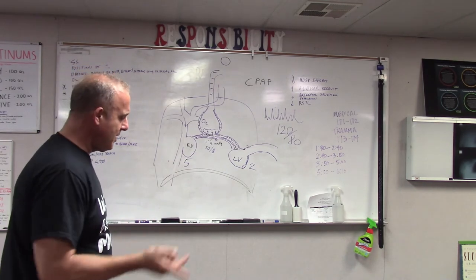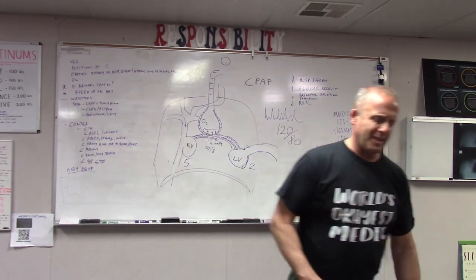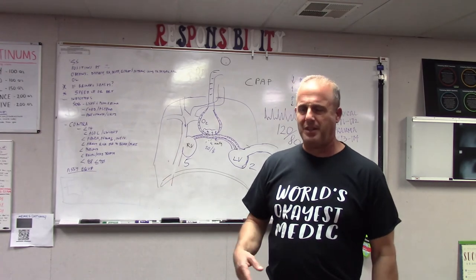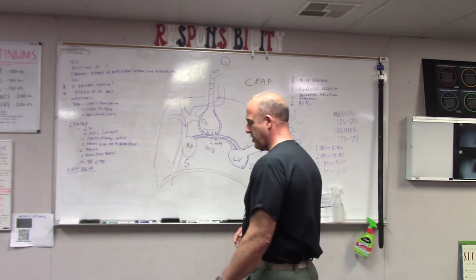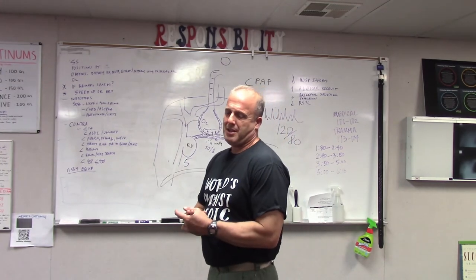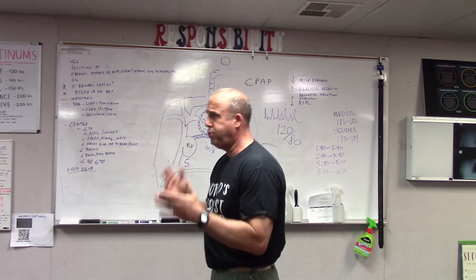Try to coach them, and before they get tired, try CPAP. On the CPAP, it's important: don't tell them to just breathe normally. That's kind of pointless because normal is not really ideal in most people's breathing. You want to think of Lamaze breathing. Pretend that patient is your wife and she's having a baby. Breathe, honey.